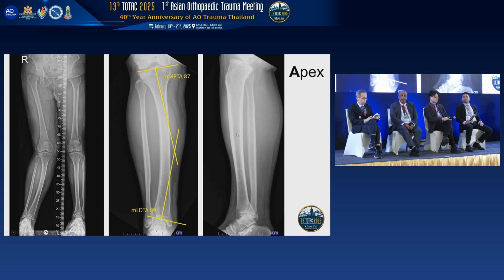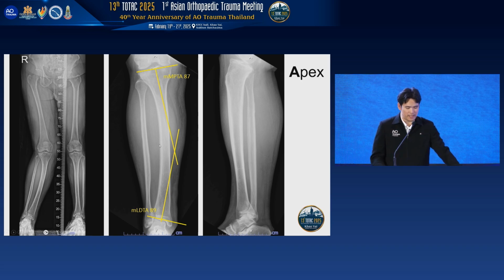Okay. So everyone can see that the apex of the CORA is outside the bone, and the bone is obviously gradually bowing. So that means there are multiple apexes, right? This is the magnitude of the deformities. We try to make the intermediate line on the intermediate segment to know where we should cut if we want to perform the double osteotomy. So this is the line that we plan to correct.